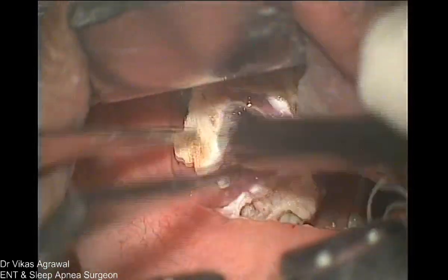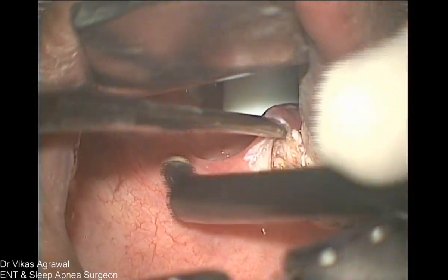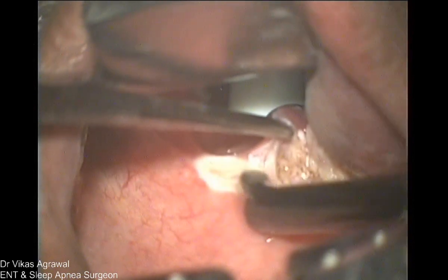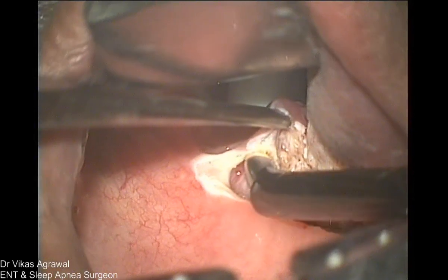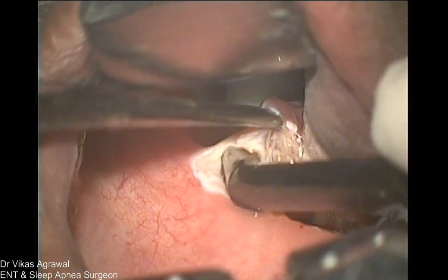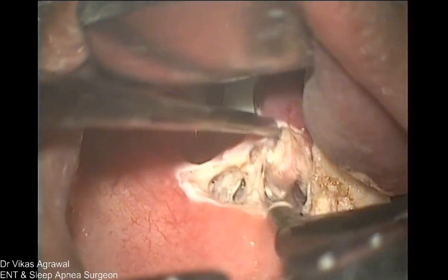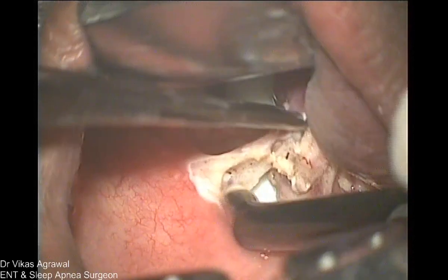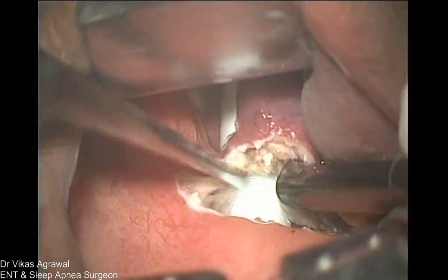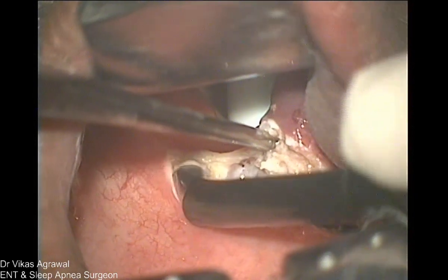Now this is the anterior pillar. I am going a little into the anterior pillar. You see, that was a small vessel which I am coagulating. And now this is the posterior pillar muscle, which is the palatopharyngeus. This is the anterior pillar, posterior pillar. I am going into the anterior pillar to go supratonsillar.